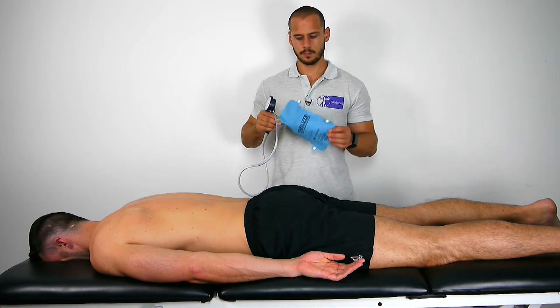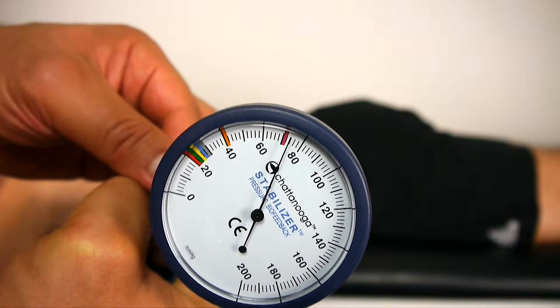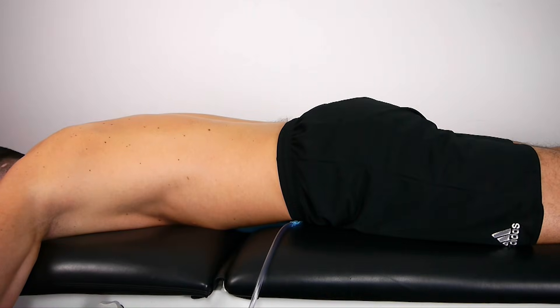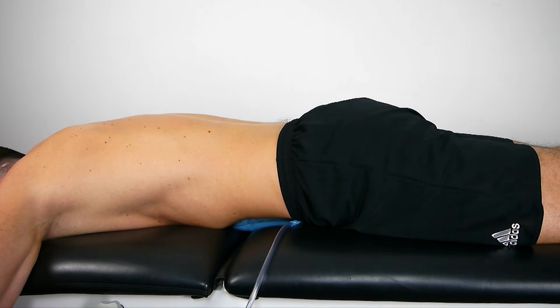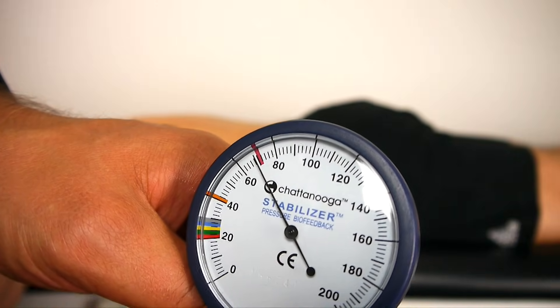The pressure biofeedback unit is placed under the abdomen and inflated to 70 millimeters of mercury. The patient is asked to breathe in and out once and then asked to cease breathing whilst performing the abdominal drawing maneuver, which should result in a pressure decrease of 2 to 4 millimeters of mercury.